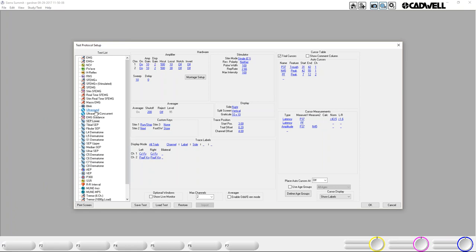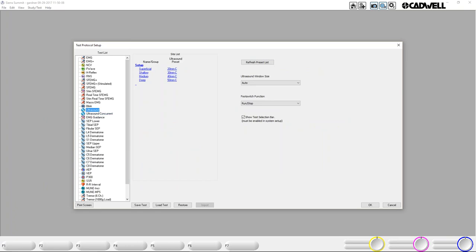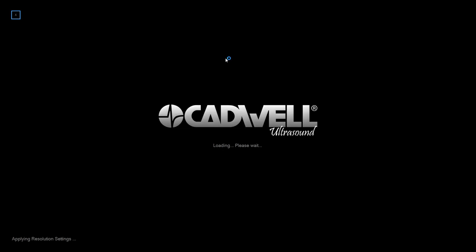Also under Test Protocols, when you go to Ultrasound, they each have unique setups. In the ultrasound setups, you can set up preset sites. You can do different depths, or you can actually do structures like median nerve, hip, or wrist — whatever makes sense. I prefer using depths, and I'll show you why as I get into it. When you create a site, just like nerve conduction, you name that site and then select what preset from the ultrasound software is going to show up under that site. There's a refresh preset list — if you've added a preset and you're not seeing it here, you'll just click refresh. If ultrasound isn't open, it's going to have to open so it can pull in the latest presets.